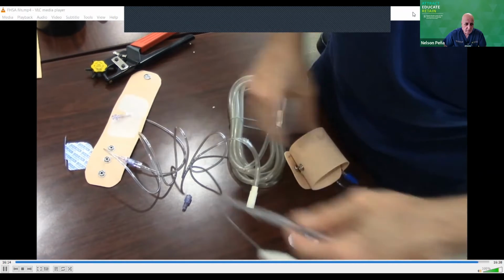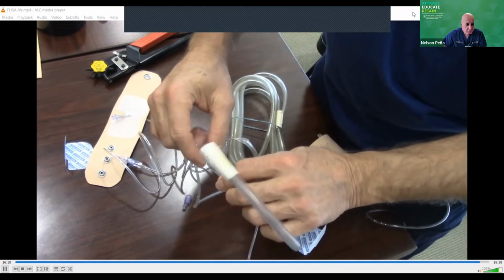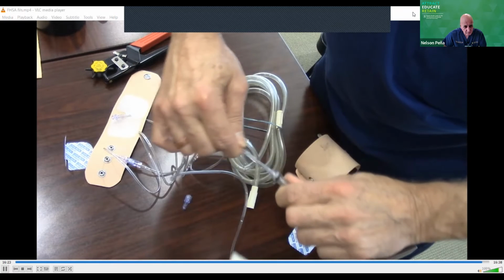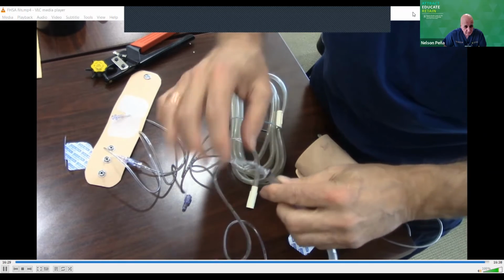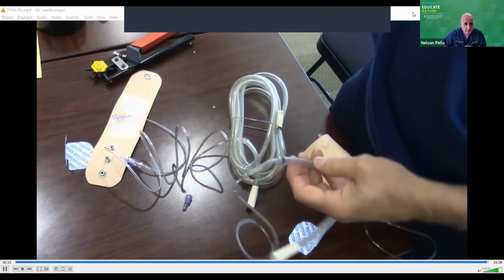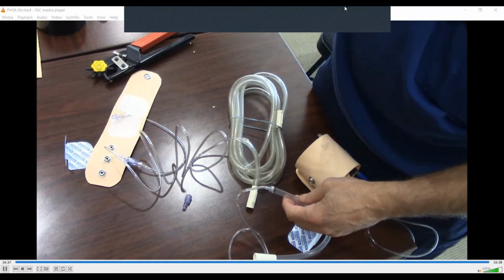All right, now here I have one that I made previously, and I want you to see where I plugged it into the suction tubing, and you can see that it's in there real solid and it's not coming loose. And there's really relatively little glue inside of here holding it, but it works like a champ. And that is how you build your own external IV. So simple, but it works.